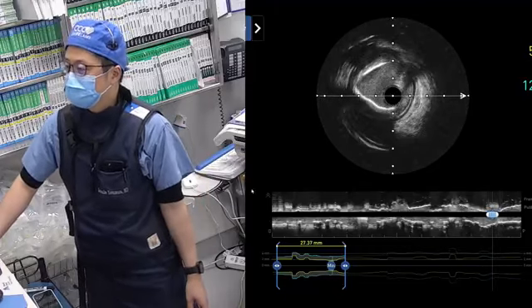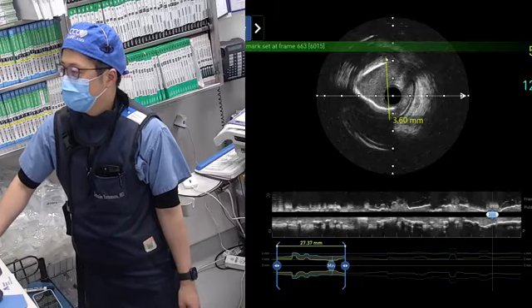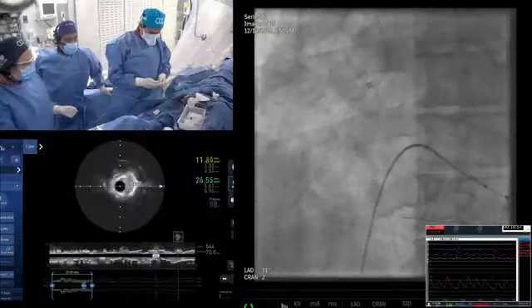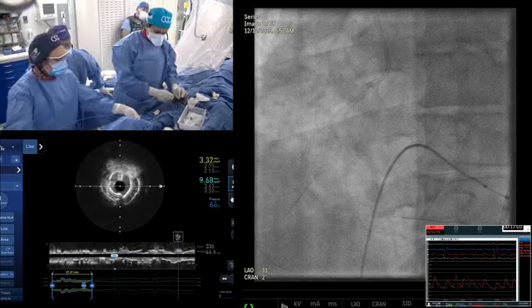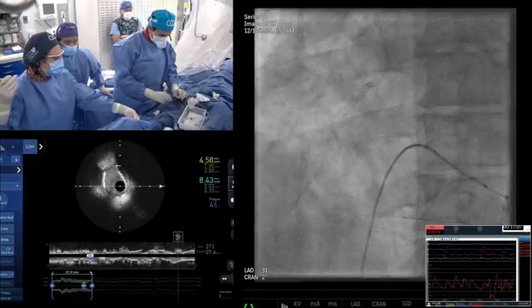Arun, your plan, any recommendation from your side? So, I was also thinking of cutting balloon. It will be 3.0 once we use it. 3.0 cutting balloon, yeah. But let's see. We're going with high pressure again first, and we have one wire cutting balloon anyway, because the rotor wire is still there. So modified cutting balloon, poor man's cutting balloon.